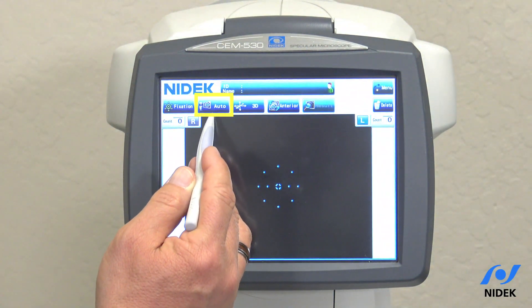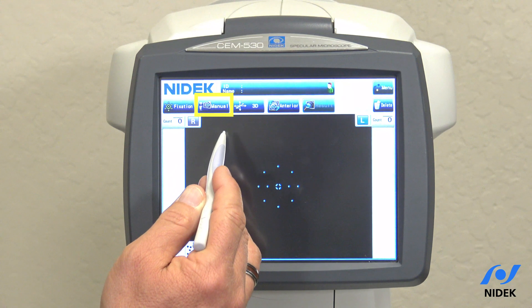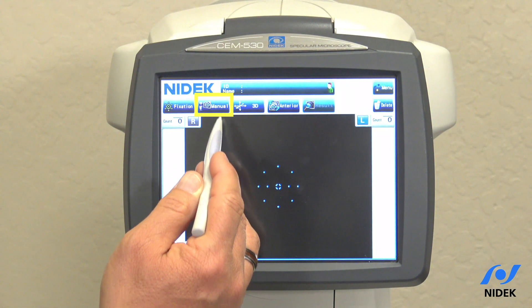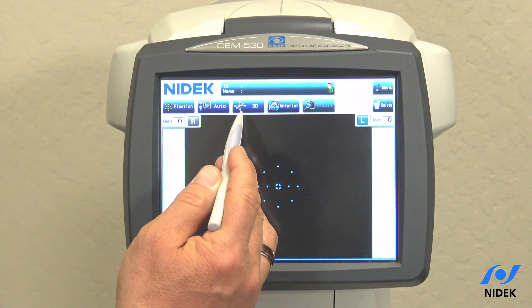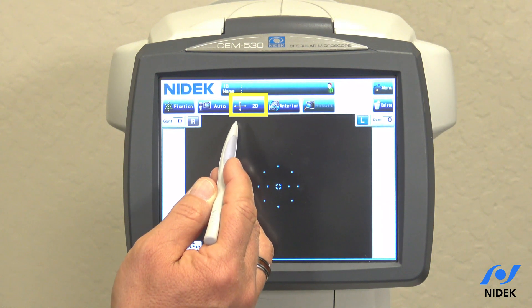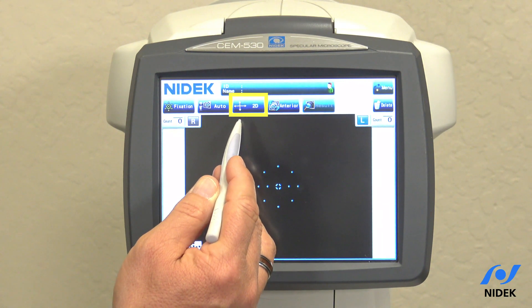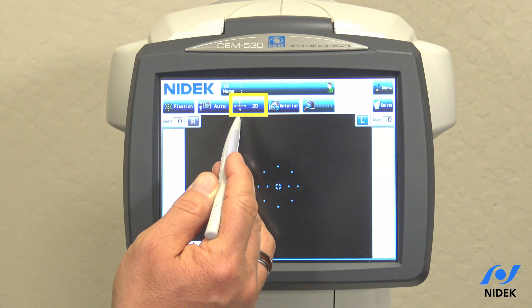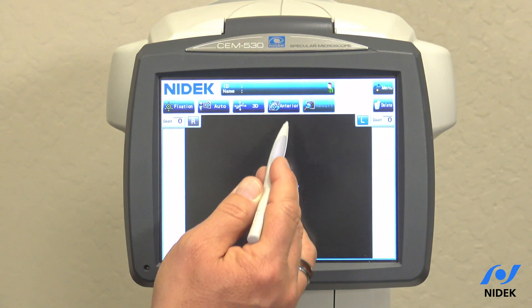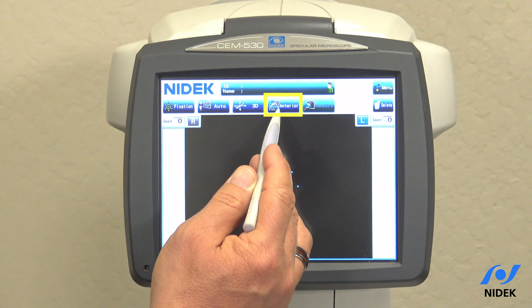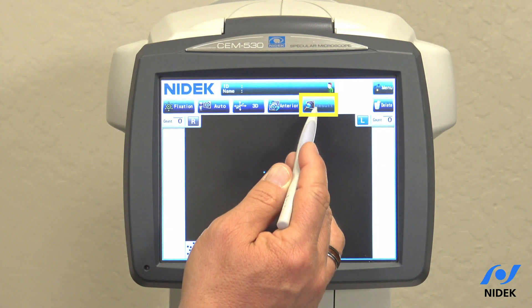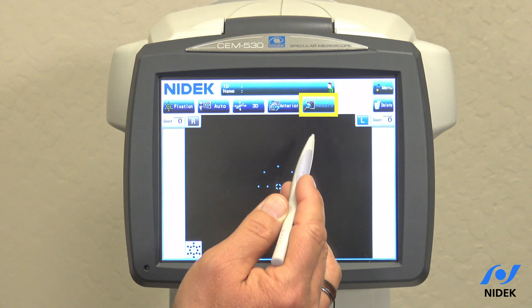Auto means auto shot. Manual means manual shot by pressing the joystick button. Auto tracking is available on all three axes, or on two axes — X and Y only, not Z — or it can be turned off. You also have anterior view and cell view options.